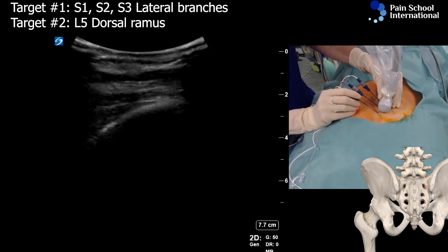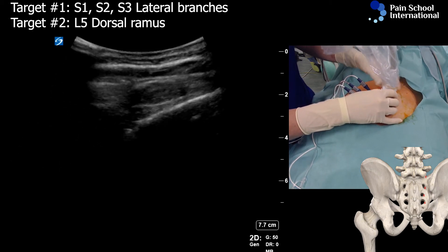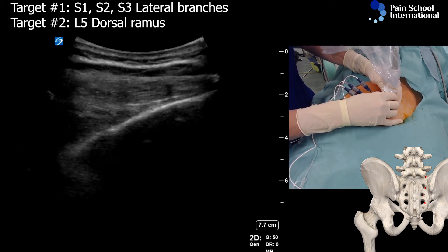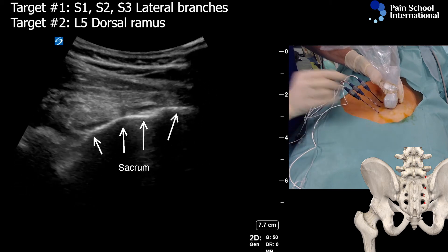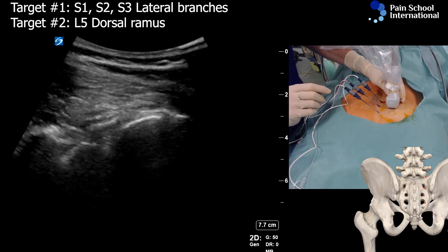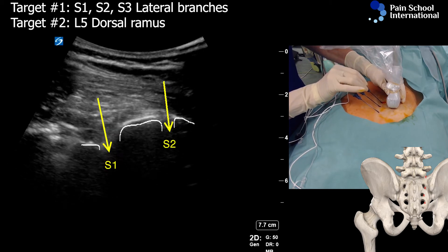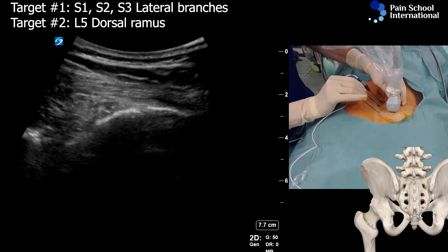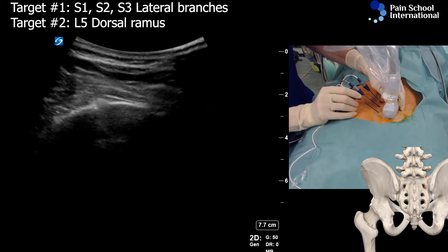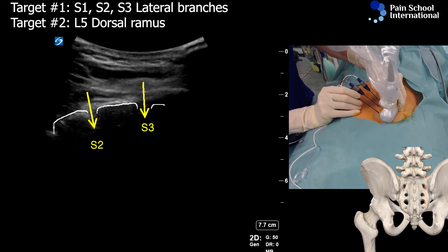Let's look at them in another view and see if it all looks good. Now cephalad is on the left side of the screen. You can see the sacrum, and if you scan laterally, you can actually identify these gaps for the foramen S1, S2, and just moving the needle — it's an okay positioning.